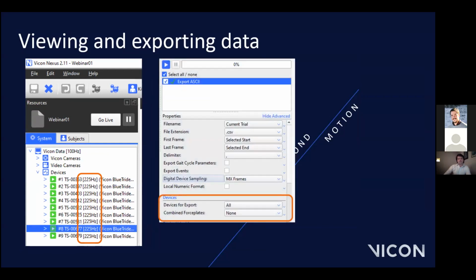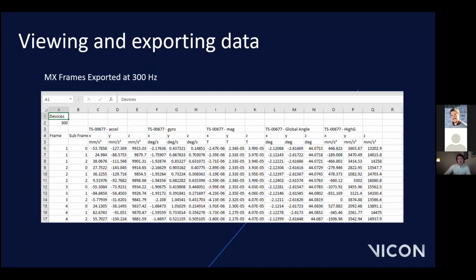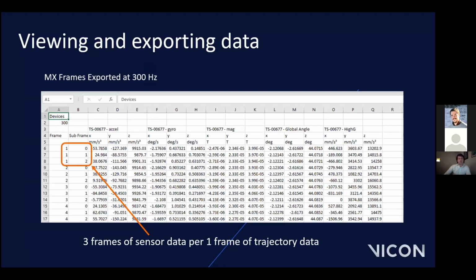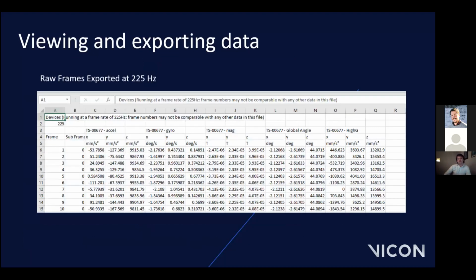You'll then be able to export this data using the export Ascii pipeline, which gives you a CSV file. And in this pipeline, you have the option to export either the raw frames or the MX frames. To show you what that means, here we have the data exported using the MX frames option. The data has been upsampled to achieve an integer number of subsamples for each trajectory frame. Or in other words, for every camera frame, we have 3 frames of data. When you use the raw frames, the data will be exported at the rate it was captured onto the sensor. In this case, it would be 225 Hertz.